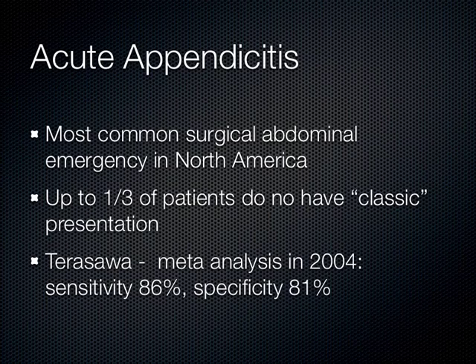Now, going forward in the future, I think ultrasound in the hands of the clinician, the person that's actually evaluating the patient at the bedside and knows exactly where the patient's got the pain, and sometimes I even hand the probe to the patient. I go, okay, put this where the pain is. And the patient's like, okay, and they stick it right where, and then I push down there, and then, oh, hey, there's the appendix. The patient found it for me. I think once we see that data start to get out there, the test characteristics will improve. In fact, in other countries where ultrasound is much more accepted in the hands of the clinician, we see incredibly high rates of accuracy with ultrasound for appendicitis.